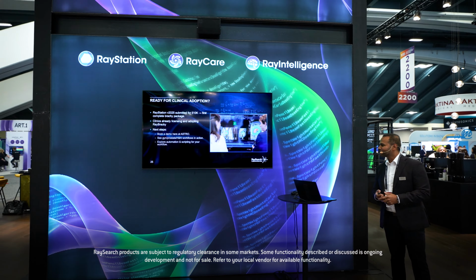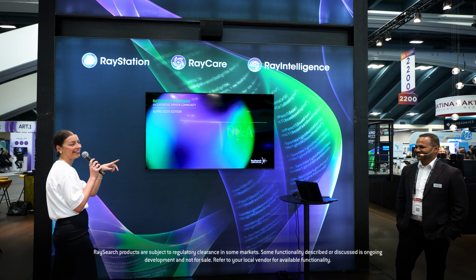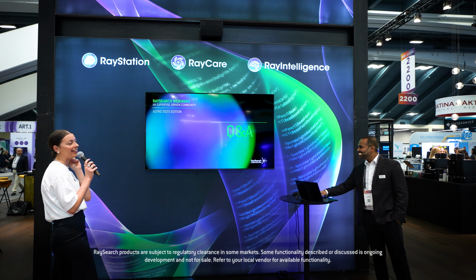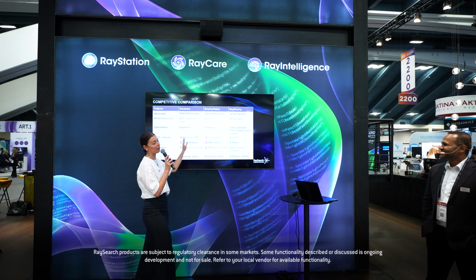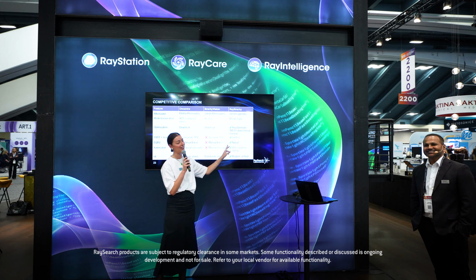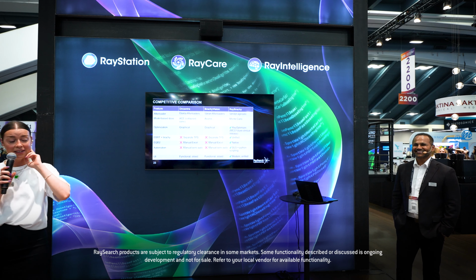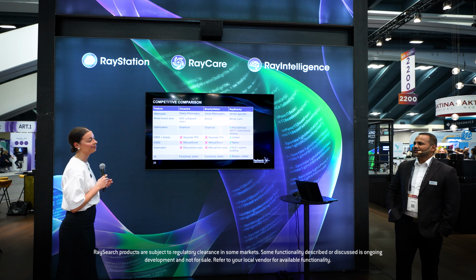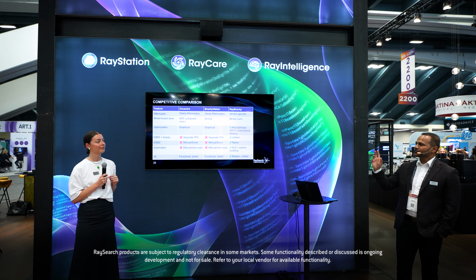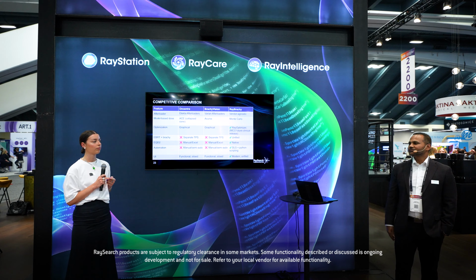Thank you, Makim. I really like to see so many green marks in one of the slides. We can come back to that slide. It's not because I care about that side, but it's seeing all of these green lights. That was nice. Purposely done. Yes. It makes it comprehensive, you know? I think we finally feel like that, and that's where, when I said there are current users that have adopted that, it is because they see the results of the work that the development team has done.